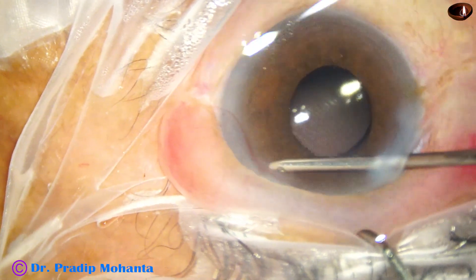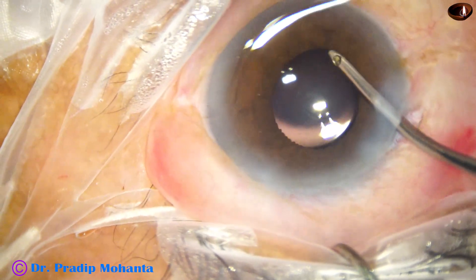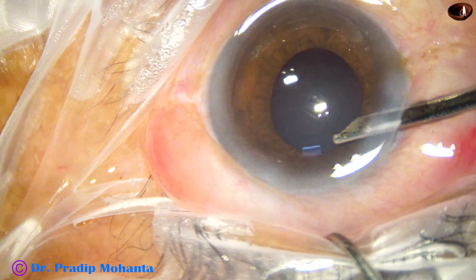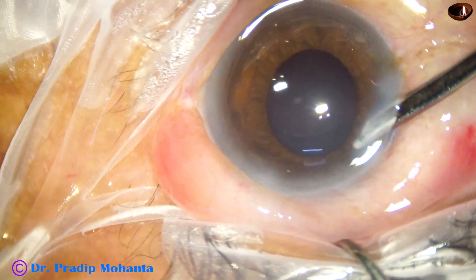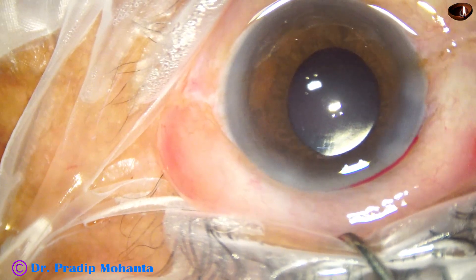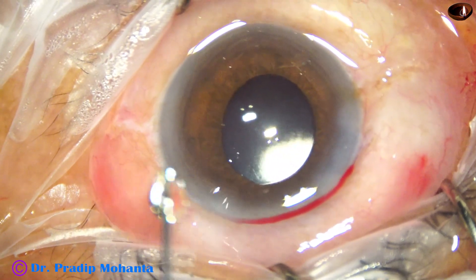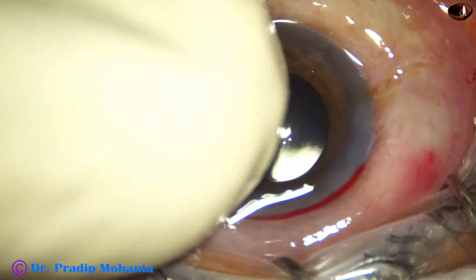And then this is a sweeping movement all around to remove any cortical matter, cells, or anything remaining in the angle, just to clean it out. And then this is the final lavage and formation of the anterior chamber with the Simcoe cannula. The integrity of the wounds are checked and a little bit of moxifloxacin is injected as the last step.